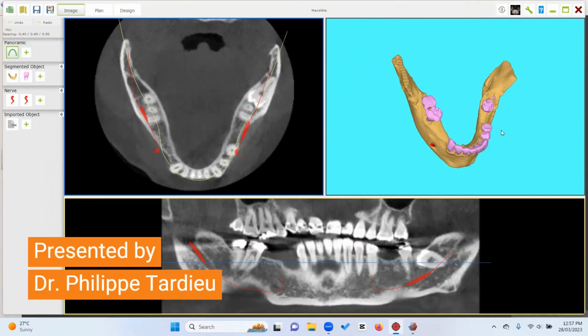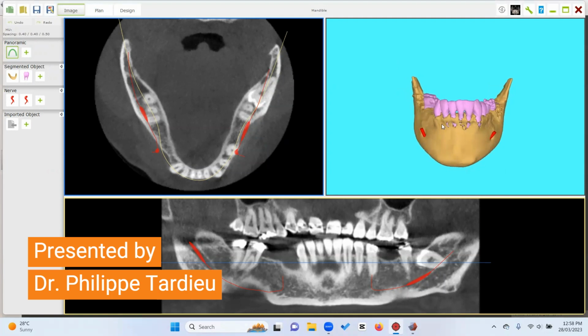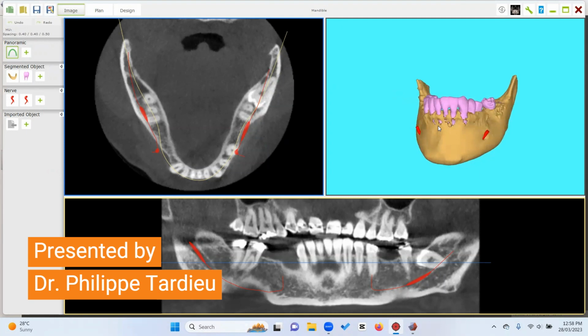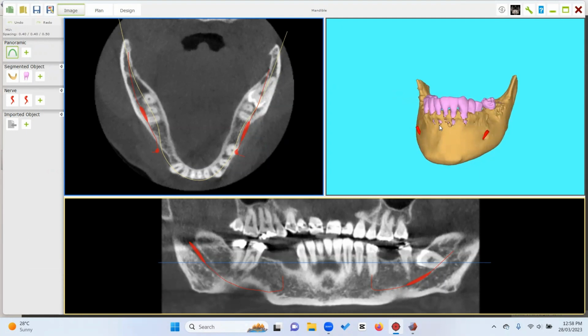Okay, we're going to show you some new work based on the 3D and on the 2D done by Arshad Alam, who is the executive manager of ANPA Medical. He has a great experience in using the different software we developed, including AxisGuide. So the issue is the following.